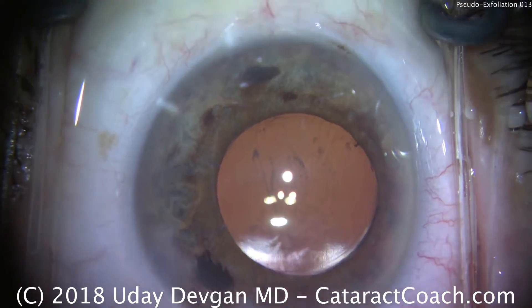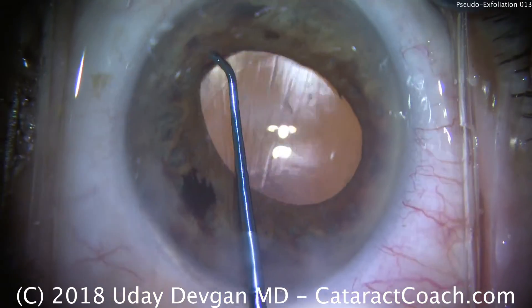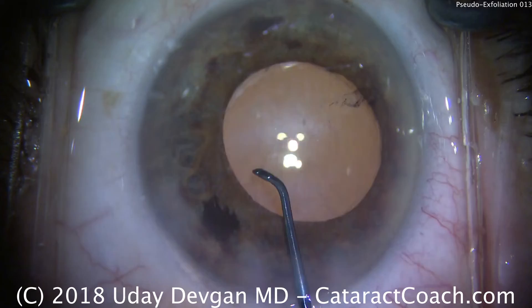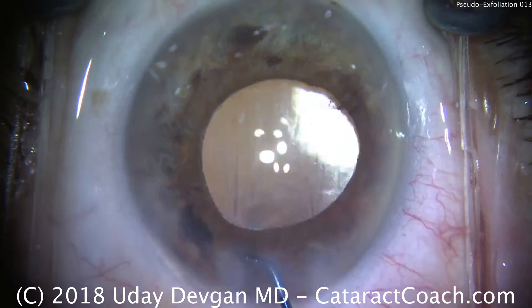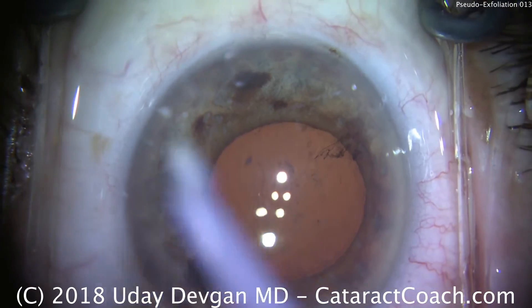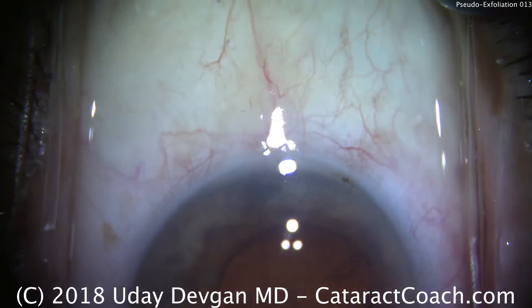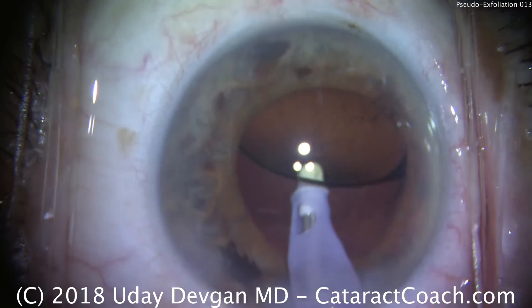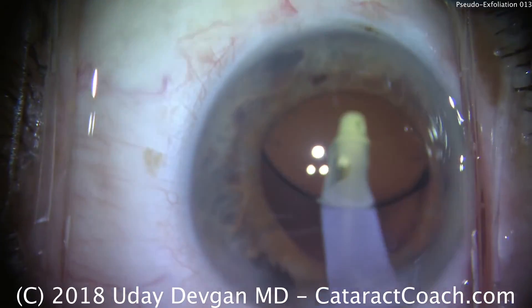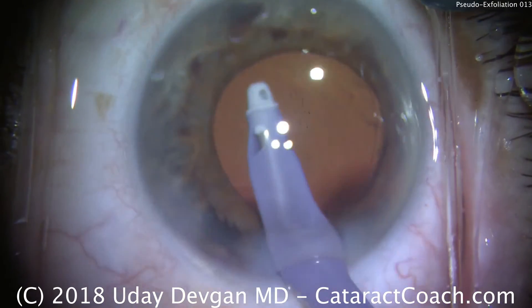Finally, the IA probe can be introduced back into the eye to remove our viscoelastic. Before I do that, though, I use the chopper to lift up the iris just to make sure there's no residual cortex and no nuclear fragments left behind. We've just checked 360 degrees — everything looks fine, no residual cataract material. Now let's remove viscoelastic from behind the IOL, and then the remainder from the anterior chamber.